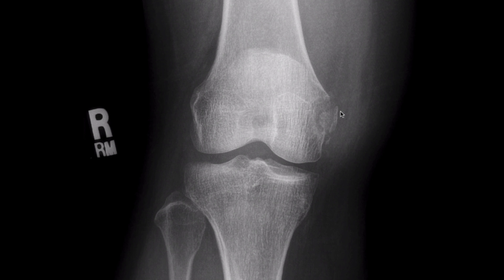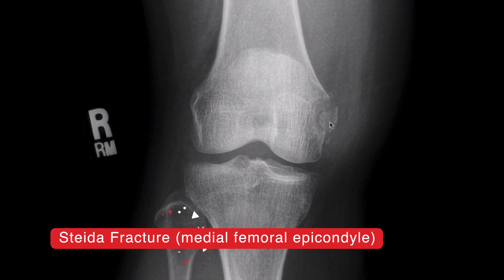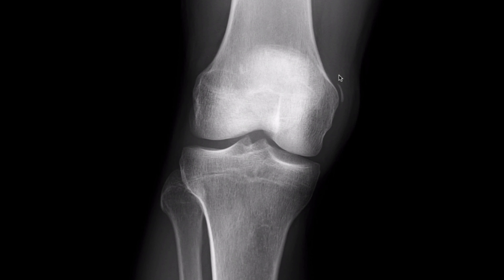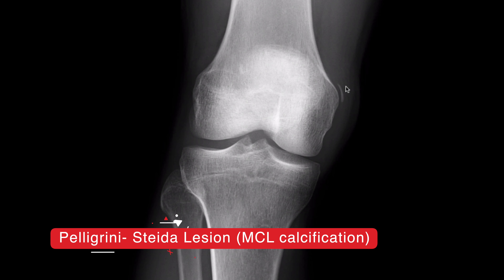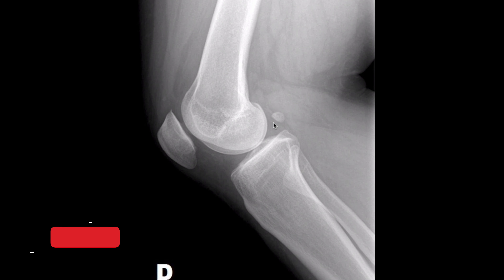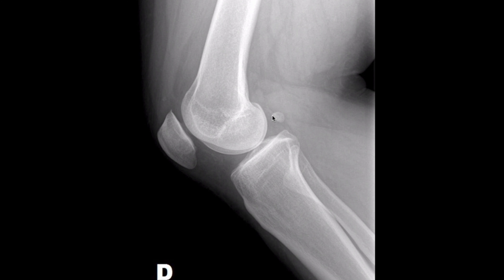In this case you can see a medial femoral epicondyle fracture called a Stieda fracture. Sometimes these can be missed or may not be visible on the initial radiograph, and a later radiograph may show what's called a Pellegrini-Stieda lesion, which is calcification within the proximal medial collateral ligament. This bone is called the Fabella, a commonly seen sesamoid bone within the lateral tendon of the gastrocnemius muscle near its attachment on the femur.